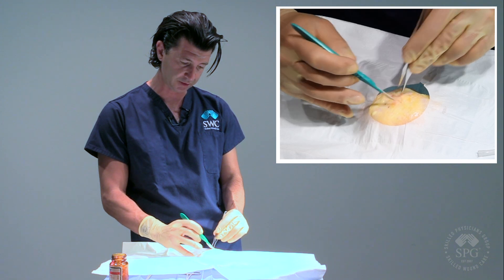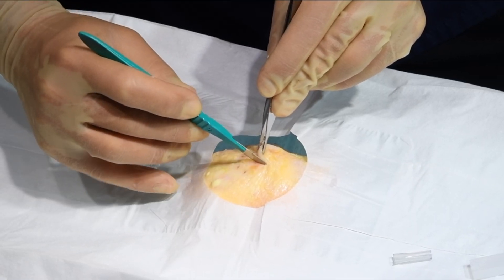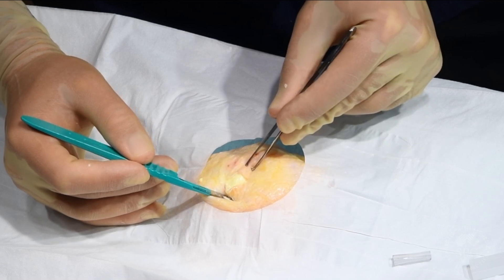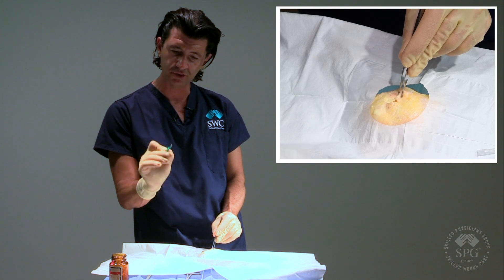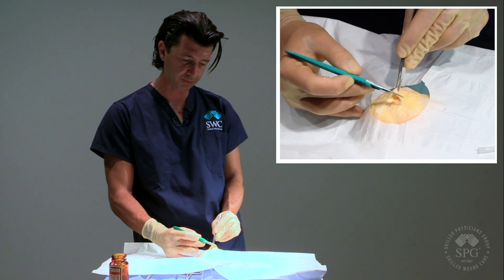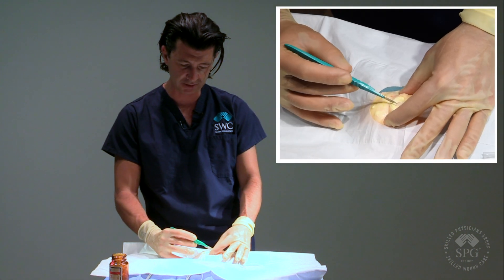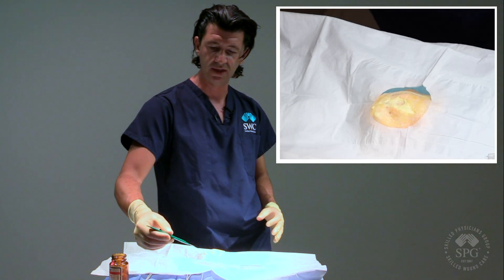Normally if you have a good abscess you will see a lot of drainage as soon as you open it up — and you can see the drainage here coming out. As soon as you open it you want to make a big enough incision. Sometimes you can turn your scalpel the other way and cut upwards so you're not hurting anything underneath. Or, if you have enough tension, the proper way is to spread the skin and go like this to really open it up — and you can see that we have the pus there.